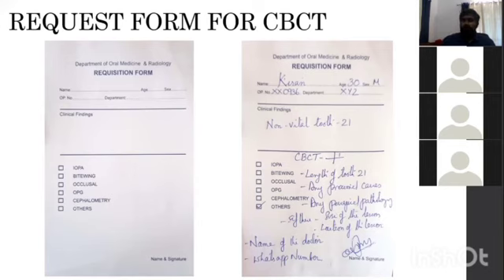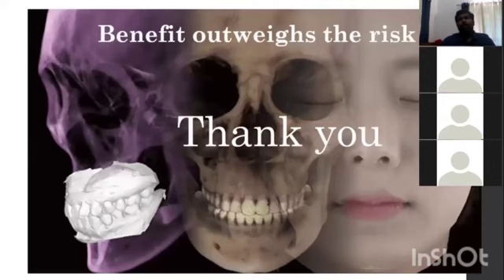And after the what, why, and when questions, another frequent question from patients is whether this radiation will cause cancer. If a diagnostic radiation risk is taken by the patient, and the patient gets some benefit from the image, then the rule is that the benefit outweighs the risk.